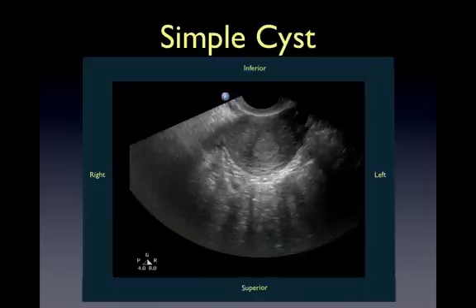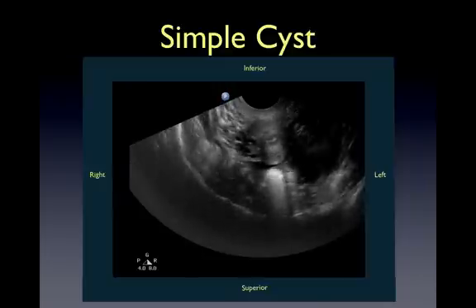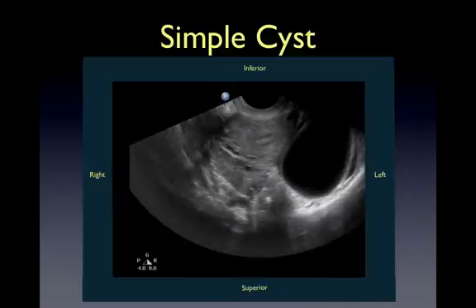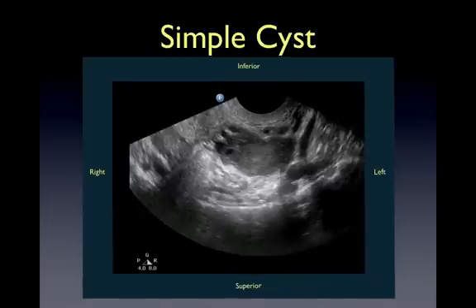Here is an example of a simple cyst on the left ovary. Note the thin wall and the anechoic fluid within it. A closer view shows some follicles within the left ovary inferiorly.